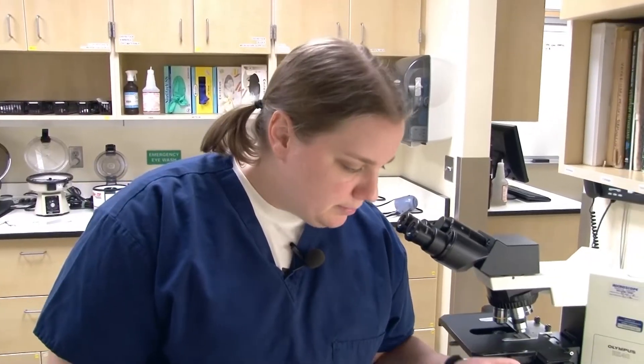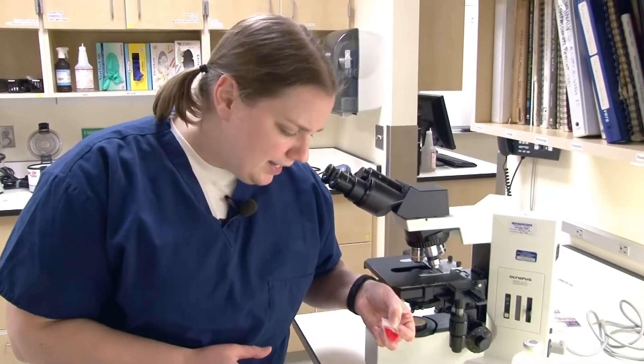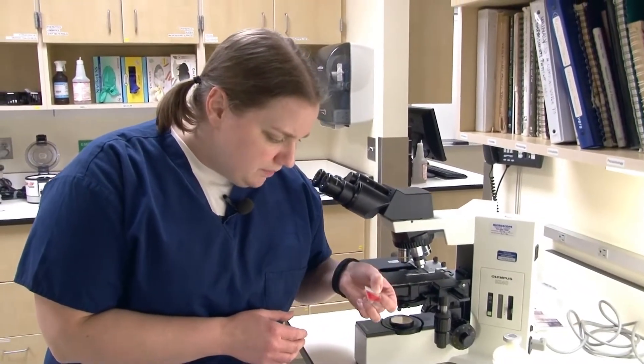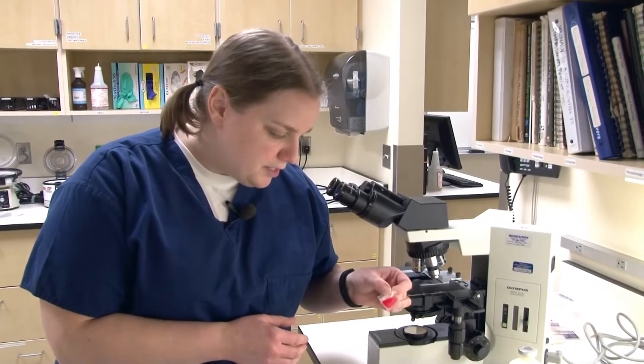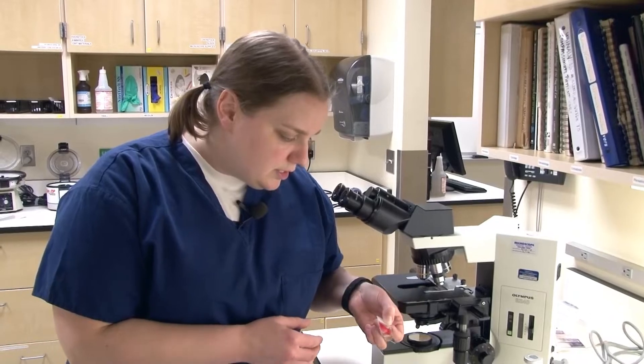Rotating my slide here a little bit, I can actually see some clumping. So I'm assuming this is going to be a positive saline agglutination test, but I always want to check it under the microscope.